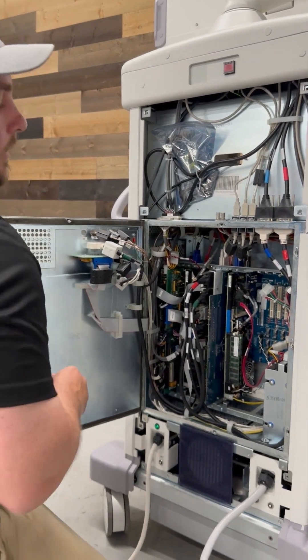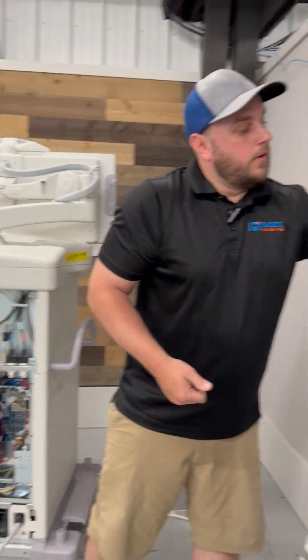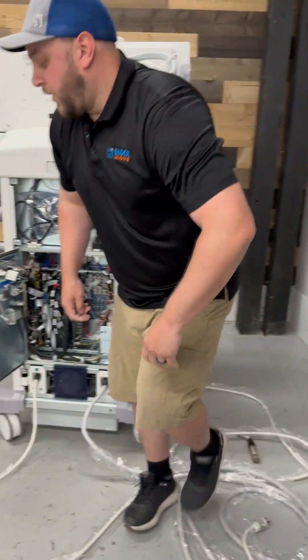They both have coin cell batteries. Now before we go and remove those, I'm going to unplug the AC power from the wall.